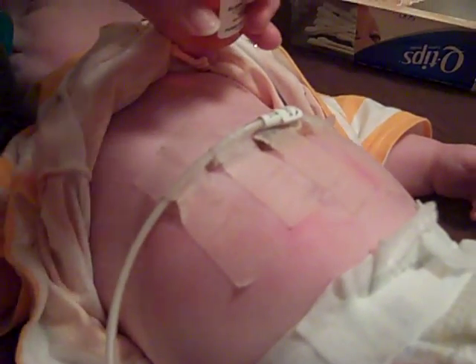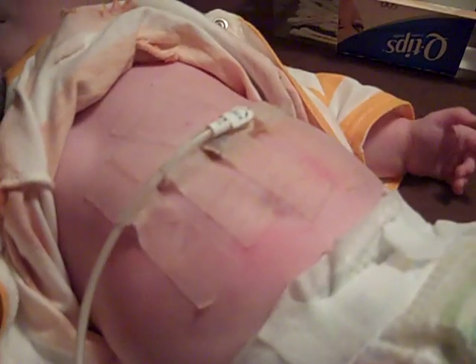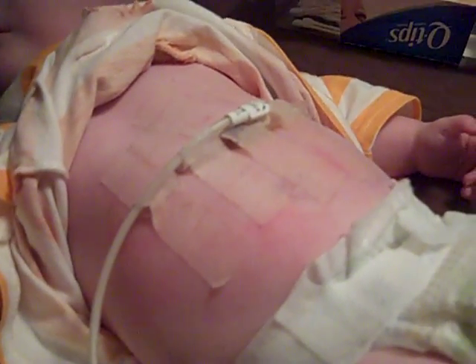Get it on there pretty good. Best thing to do is just coat it, and then it comes right off. And then of course make sure that your own child doesn't take it out for you. So get the lid back on that, because that is greasy. And then you'll see in just a second it'll start to loosen it, and it'll come right off. So we'll wait for that for just a minute.